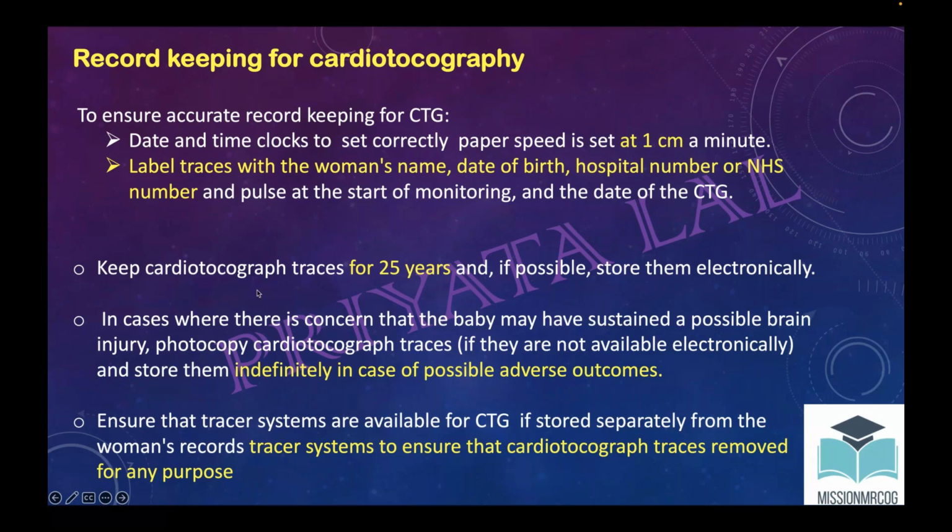The CTG is to be kept in your recording system for an indefinite period of time. Apart from this, sometimes people take the CTG trace for teaching purposes or whatever purpose.